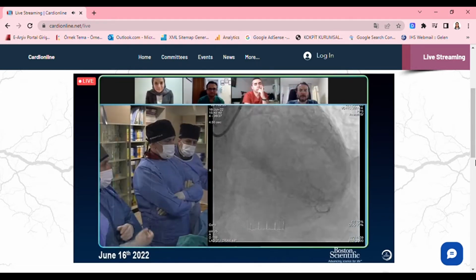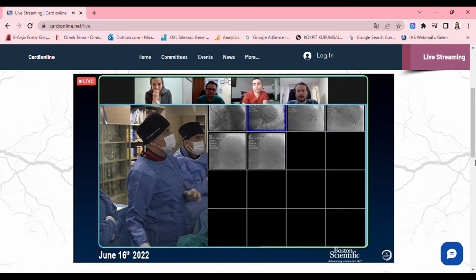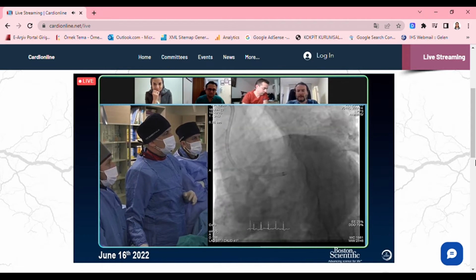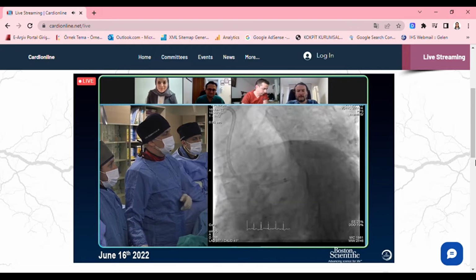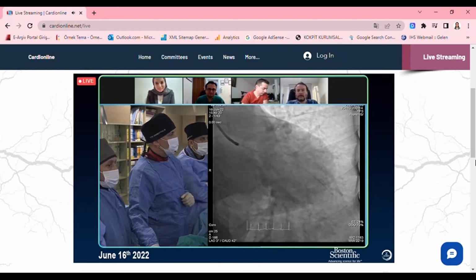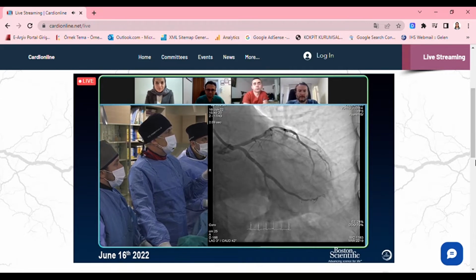Right. So let's show you today's angio we have done. Can you bring up the first image for us, please? Yes. You saw that the RCA and circ lesion were already treated, and this is the circ, which looks very nice, although the final image of the small circ was not good. After 2 weeks, we have nice circ filling. Do you see that? Yeah, it's definitely better than what you left with. Yes, it's better now. I think the expansion of this stent looks quite okay for us, at least by angio. This is the spider view.